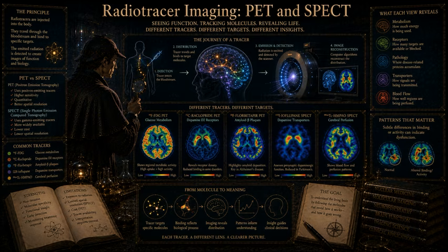Before we move from the scanner hardware into the pharmacokinetic mathematics, we really have to pause and address the elephant in the room, which is patient safety. We have spent half an hour talking about quantum annihilation, gamma rays, and radiation. If I am a patient or a healthy research volunteer, and you sit me down and explain that you are going to inject me with radioactive isotopes, my immediate reaction is going to be alarm. What are the actual risks?